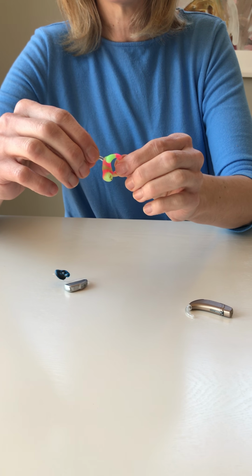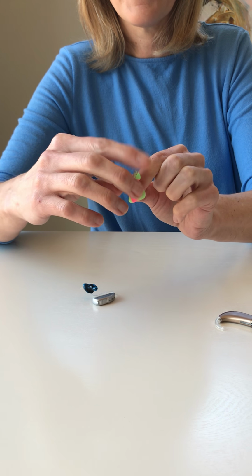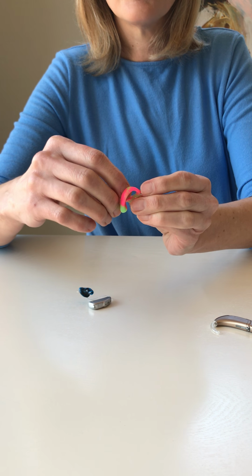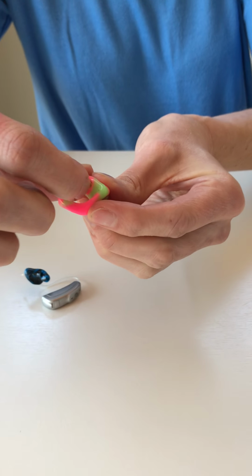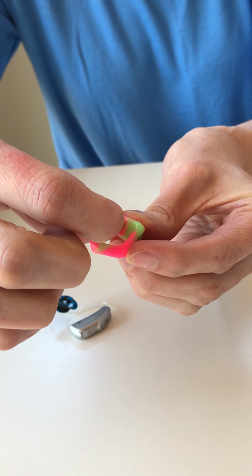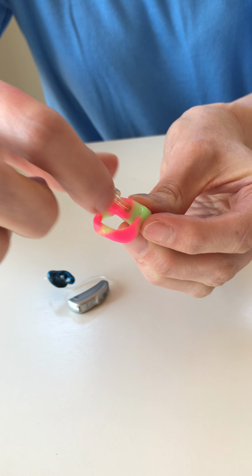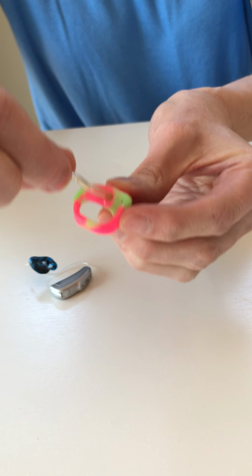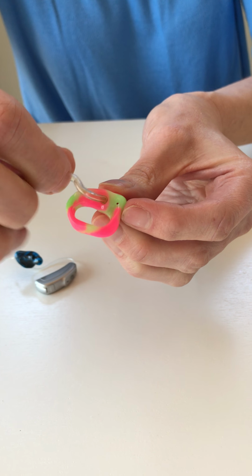If instead I've taken these two apart and I hear this part whistling, then I know that there must be a blockage somewhere in this ear mold that I just am having trouble seeing. So first I'll take a look at the tube itself. Do I see any holes, any tears? It's not uncommon to see a tear right where the tube enters the mold. That could be my problem. So if I see a tear, if I have tubing at home and I'm capable of doing that, I could go ahead and retube it, or I would call my audiologist to ask them to retube it for me.